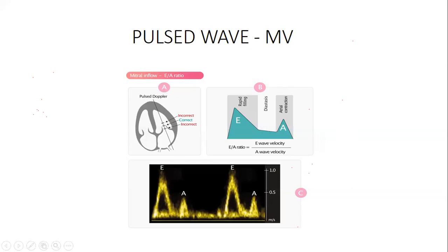I'll explain this during diastolic dysfunction, but I want you to see that the E is picked when there is early filling or rapid filling of the left ventricle. When it's filling, a lot of blood will pour into the left ventricle and give you this E. Now, some blood will remain in the left atrium. The left atrium will contract and squeeze the remaining blood into the left ventricle. It's called the atrial kick, which is labeled as the A, the E and the A.